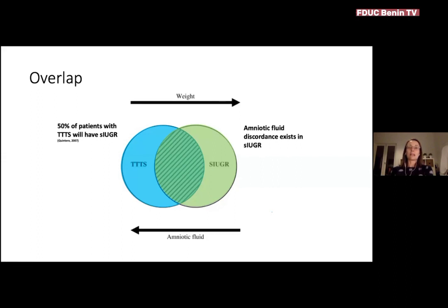Again, in selective IUGR, the larger twin won't have a large tense bladder like they do in twin-twin transfusion syndrome. And in the recipient twin in twin-twin transfusion syndrome, there might be abnormalities of cardiac function, which you wouldn't expect in a normal sized twin of selective growth restriction. So they're the tips I have in determining whether it's definitely a twin-twin transfusion syndrome picture.